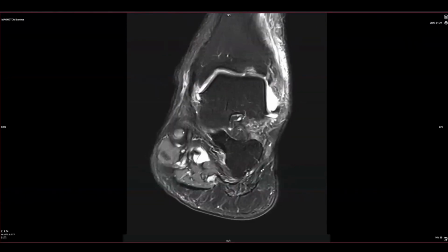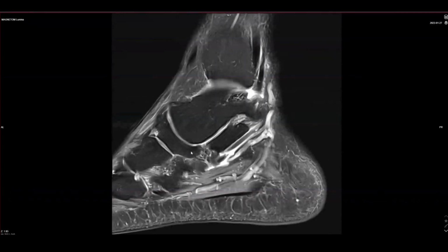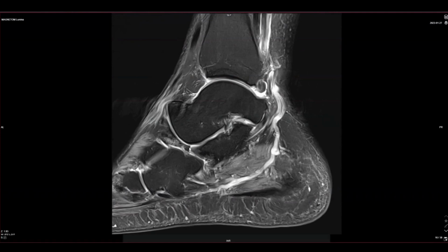On this initial examination also, let's take a look at the remaining. We have a comma-shaped navicular that's quite locked in there, that's going to restrict motion in this particular area.